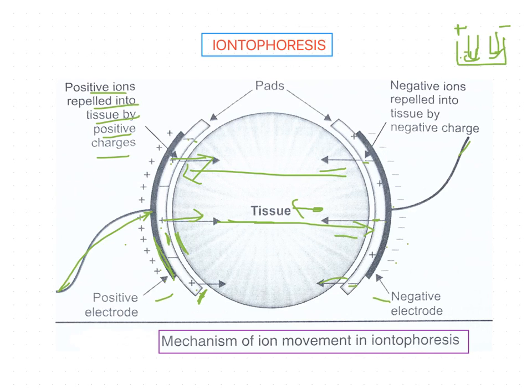An additional mechanism of drug delivery involves the passage of solvent, which can carry dissolved substances through the skin due to direct current. This form is called electro-osmosis, and it is strongly dependent upon the pH of the skin. So this mainly depends on the pH of the skin.